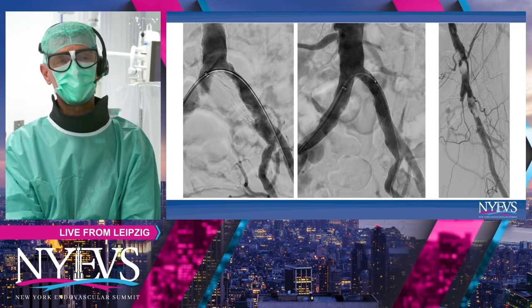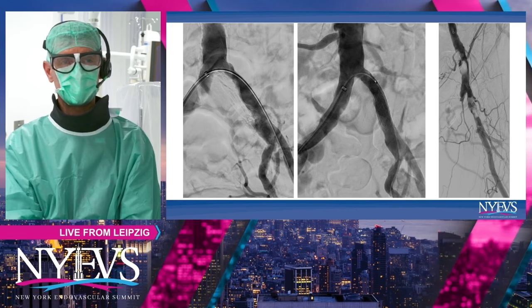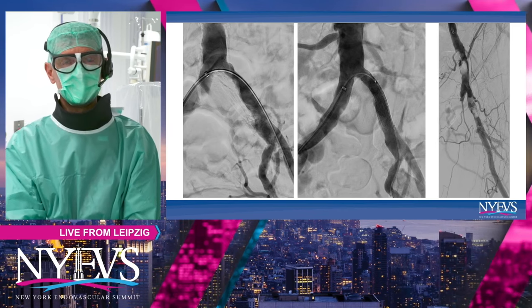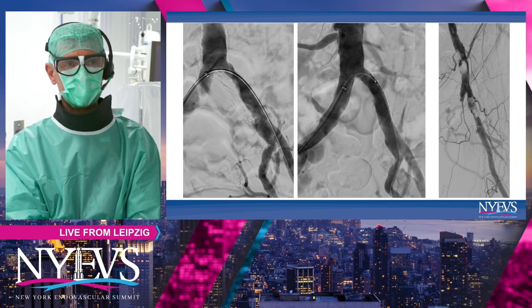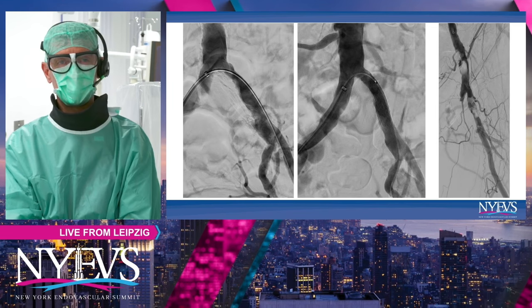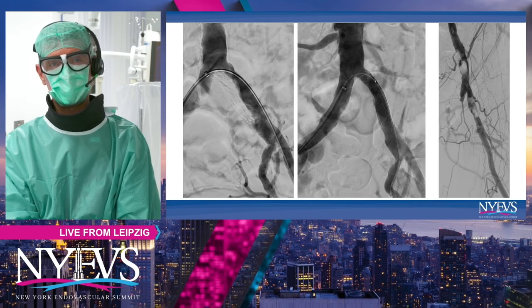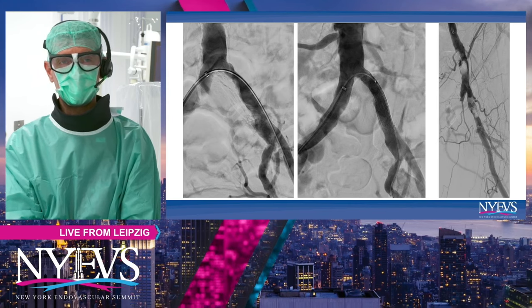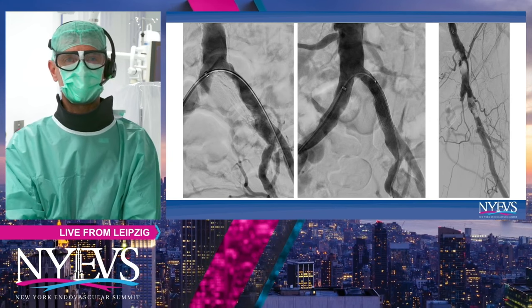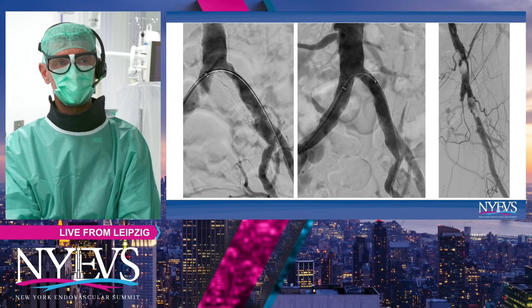He had some treatment first of a common iliac on the left side in another hospital, not very tight, and it didn't really help so far. Now you can see on the right side this common femoral artery subtotal stenosis, very calcified. It goes a little bit into the external iliac, with some disease in the profunda and a total SFA occlusion.